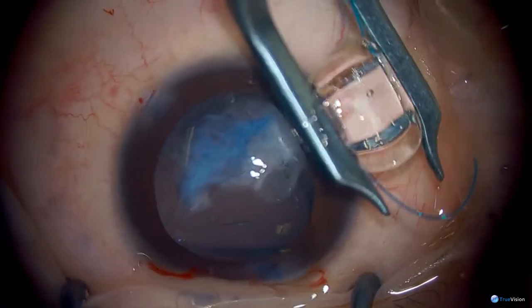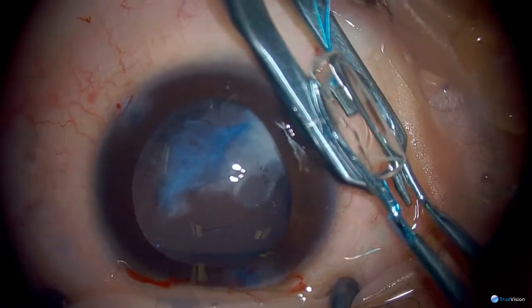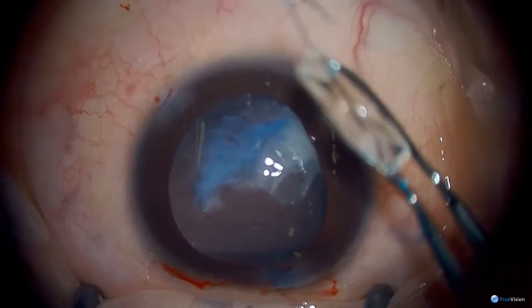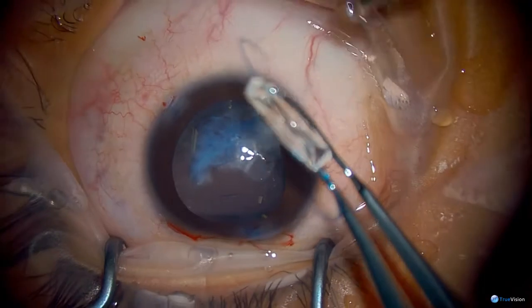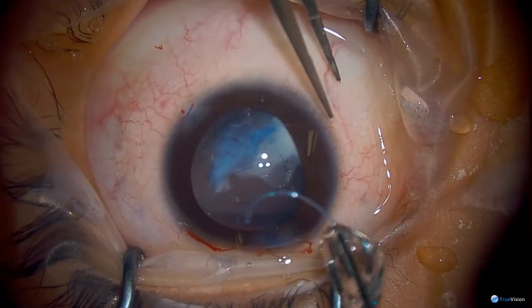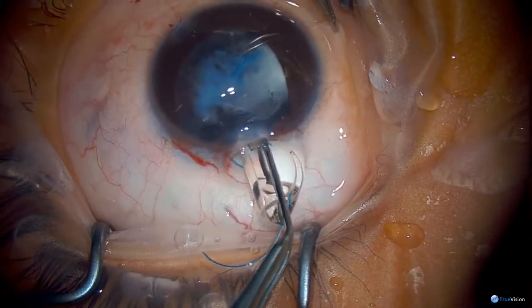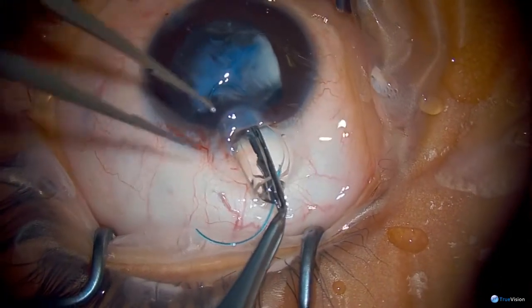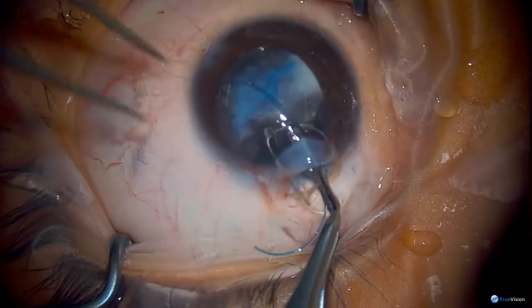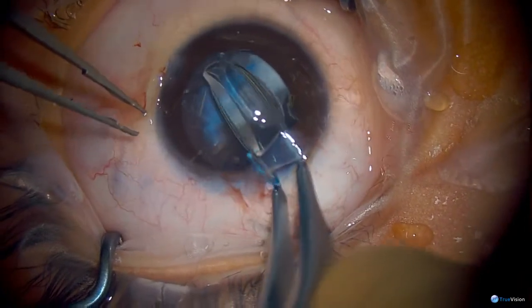Now this is a plus lens, so we're going to be using a three-piece lens for the sulcus. And once it's in place, we're going to open the posterior capsule and do an anterior vitrectomy. So we're just going to introduce this into the eye, get some countertraction here, and then make sure the lens goes into the sulcus, pulling it out. So the lens is in the sulcus right now.